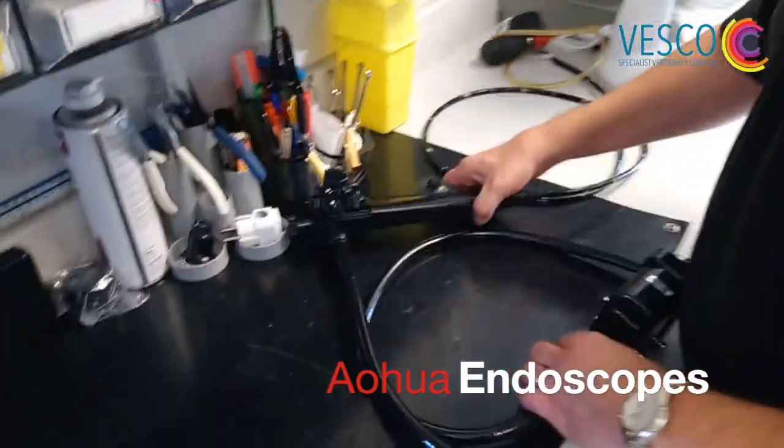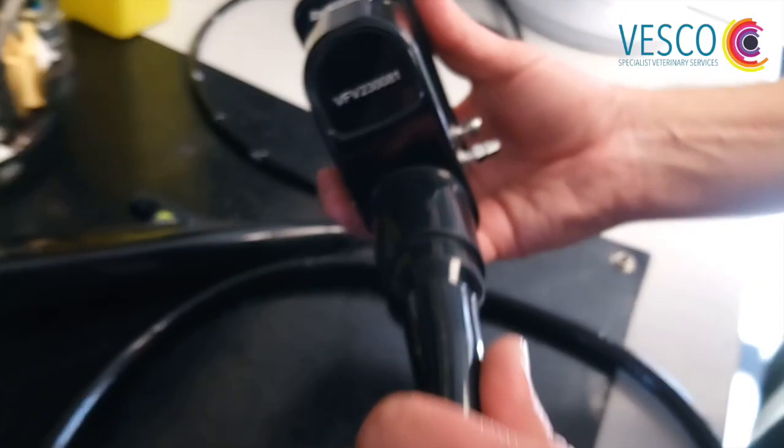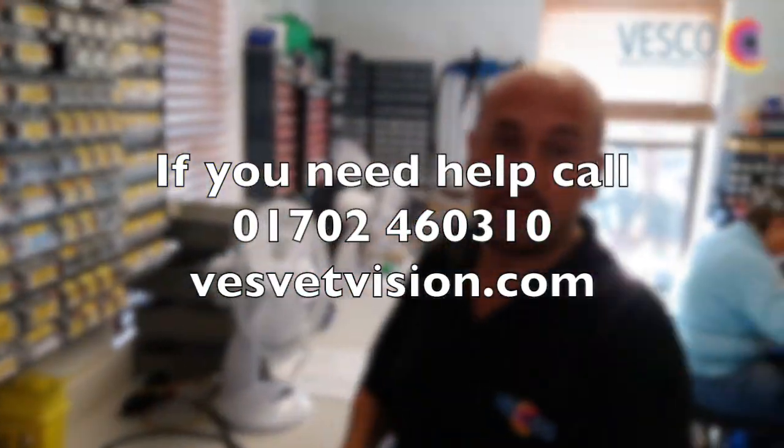The same as the others — the biopsy port will show your model. This is a Fujifilm scope. The serial number is found on the plug as well, and that is how you identify your scope.